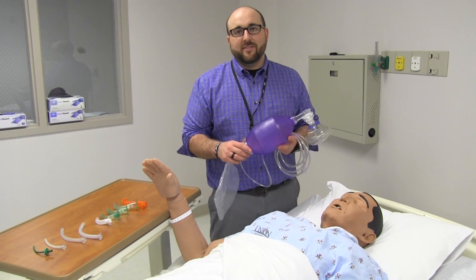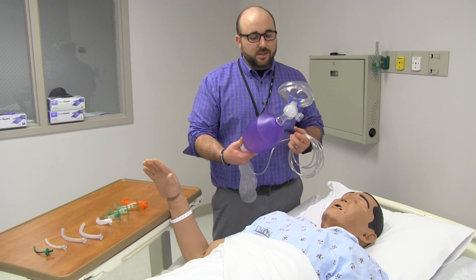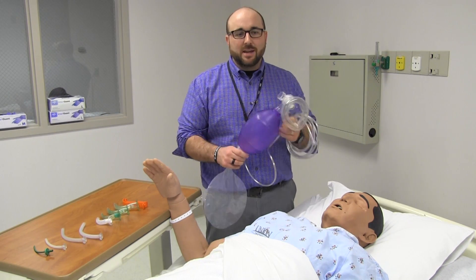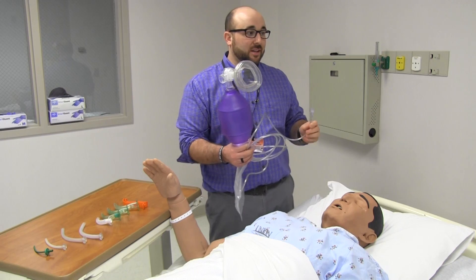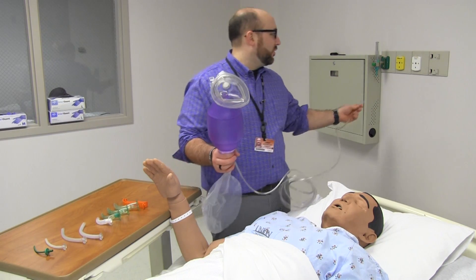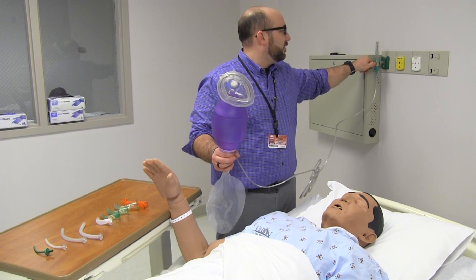I'm going to show a little bit about our bag valve mask. This is a standard one that you'll find — the one we use in the hospital here. They're pretty much all the same. A couple of big keys to it: make sure that you're always delivering 100% oxygen into this, which is usually what comes out of the wall at 15 liters. I'm going to hook this up to our flow meter and turn it up to 15 liters.